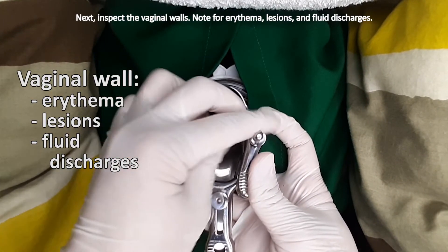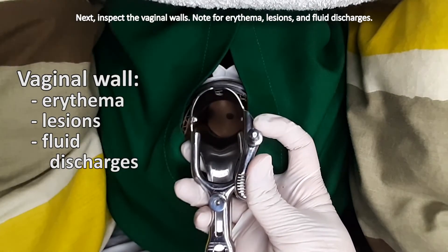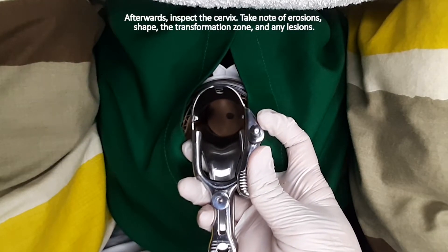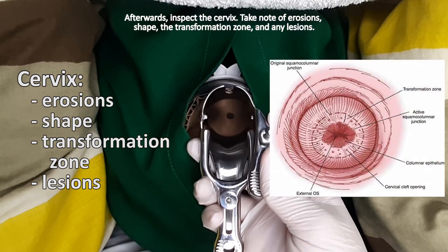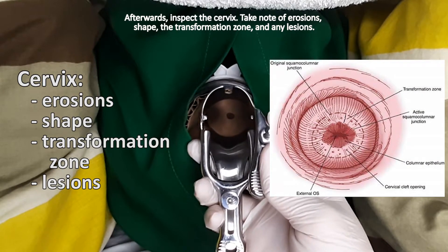Open the speculum and visualize the cervix. Next, inspect the vaginal walls. Note for erythema, lesions, and fluid discharges. Afterwards, inspect the cervix. Take note of erosions, shape, the transformation zone, and any lesions.